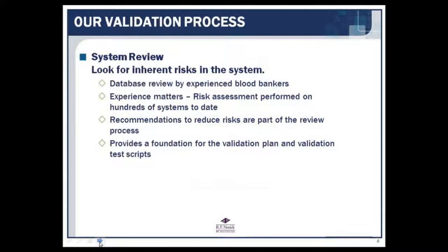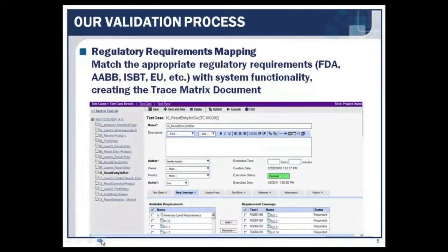Before we even start a validation, RF Nozick and Associates validation managers perform a system review. They review the database. They look for inherent risk. They come up with recommendations whenever they see that. The system review provides the foundation for the validation plan and the validation test scripts. Next slide, please.